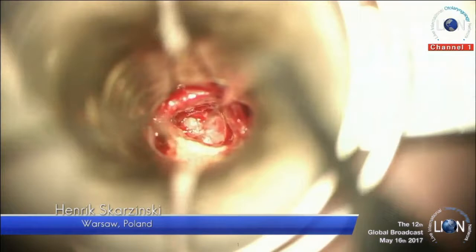So we have to be really sure. We will now see the cement procedure. We have to be sure that first, the ends of the bones are dry, because that gives better connectivity. And second, that the connection will be proper, because it is not typical — there is a little bit of distance between the bones.